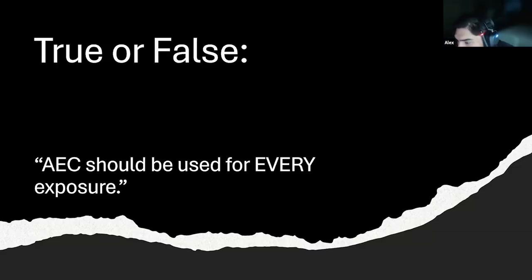He typed in the chat false. Okay, false. AEC should be used for every exposure. The answer is no. Interestingly, when I first started at Cedars, there were at least some technologists who believed that if you were experienced, you shouldn't use AEC at all. You should only do manual, and that was an interesting thought because I can see the point very much.